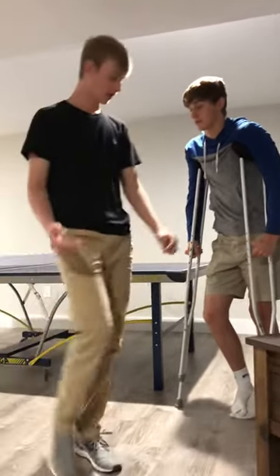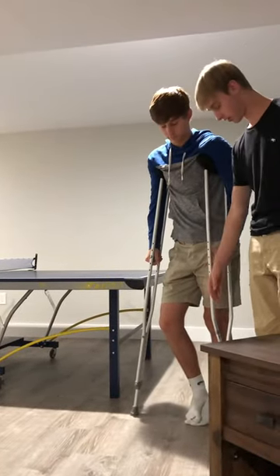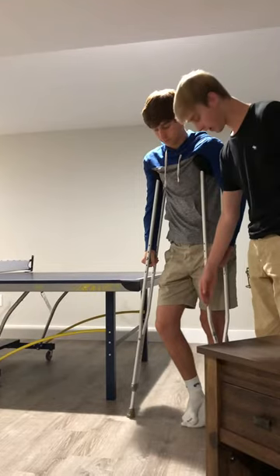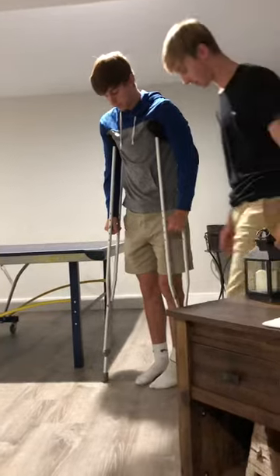So after we got the fitting, I'm gonna tell you how to hold them. The crutches should be 6 inches out from your foot and 2 inches in front. So these are already there.